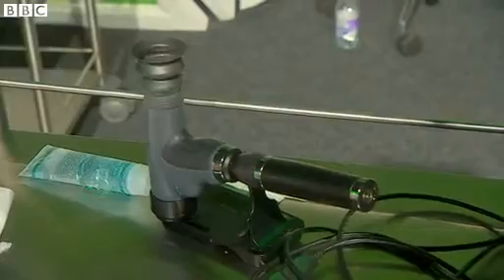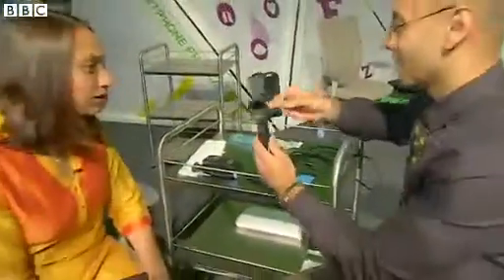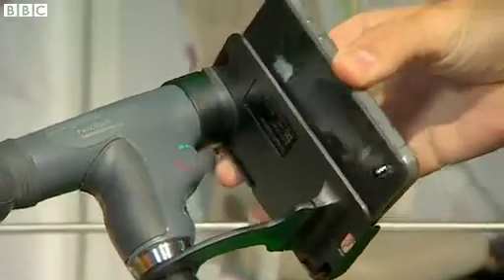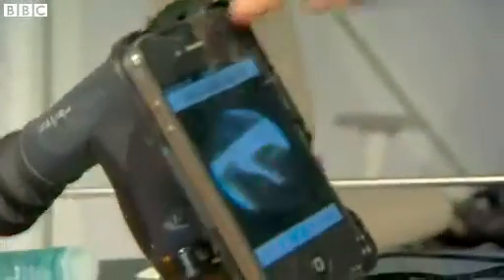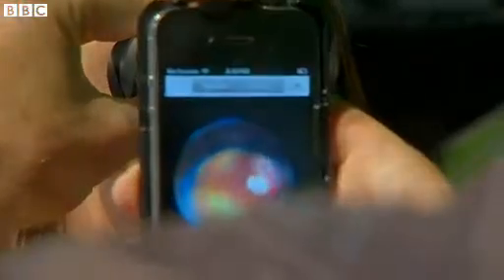Next we have a device called an ophthalmoscope — it looks kind of scary but it isn't. Basically it has this case that you can plug your iPhone into, just like the last device, and it just snaps on like that. It aligns the camera of your phone to these optics in here, and using this I can get a picture of the back of your eye — your retina. Just hold steady for a few seconds. This is your retina, right there.